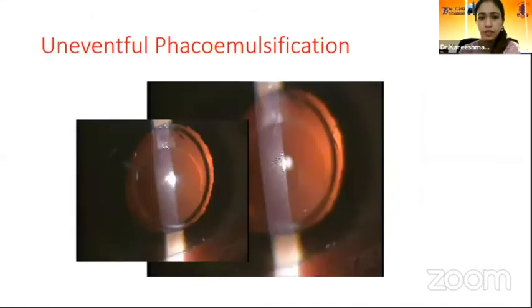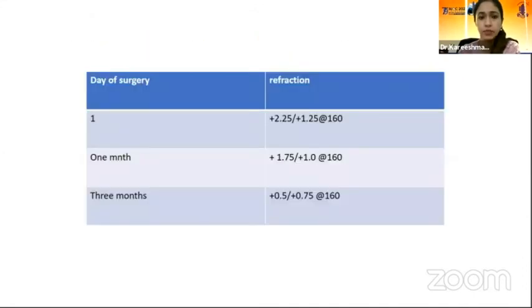We did an uneventful phacoemulsification, but we got a post-op surprise of 2.25 with a slight cylinder on day 1.